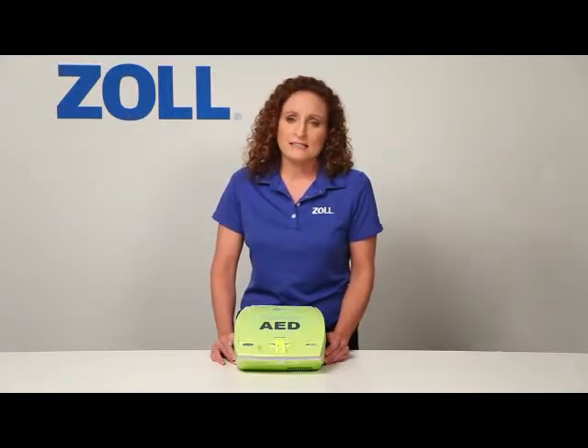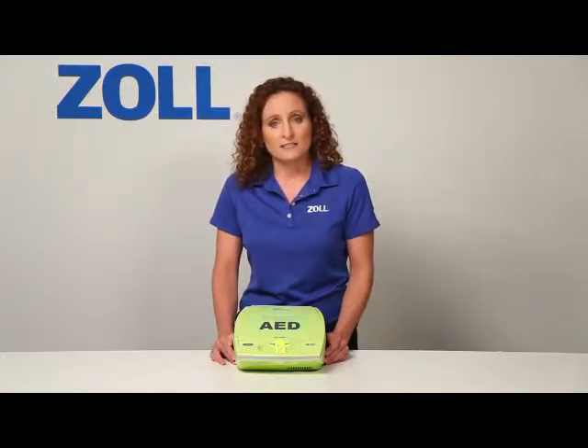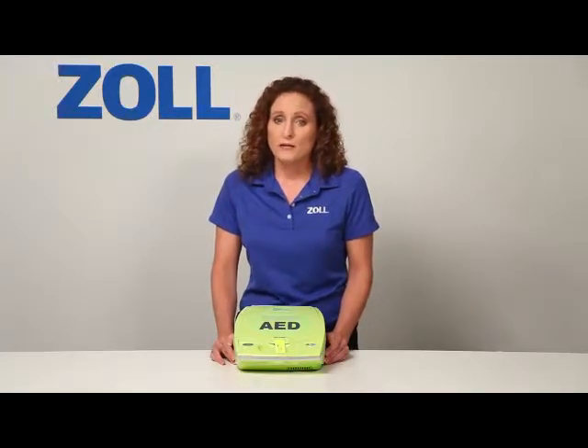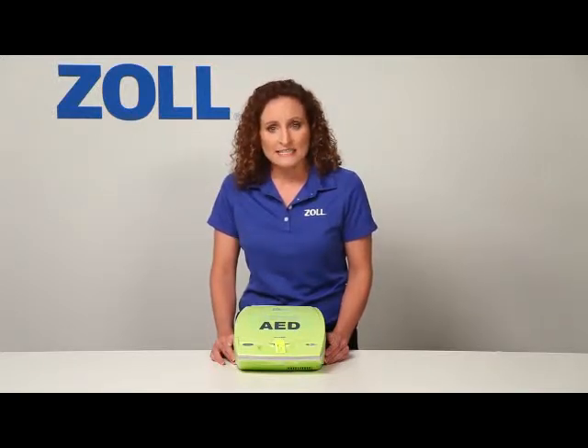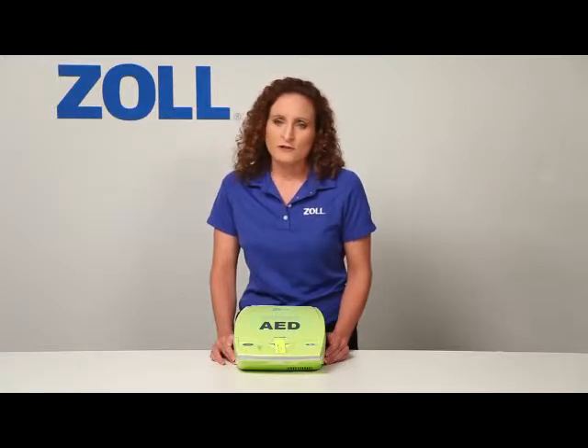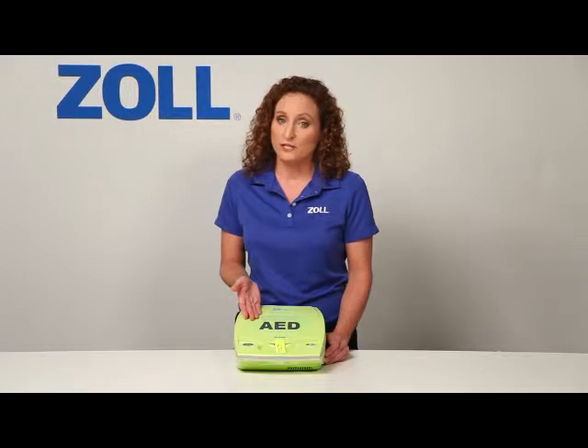Once your AED says no shock advised, only CPR can save the victim. At that point, you have to ask: will my AED support my CPR by guiding my rate and depth? If you're not using the AED Plus, it won't help much at all.